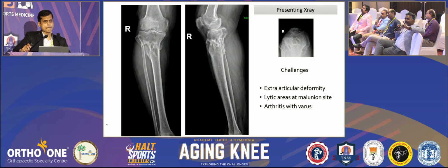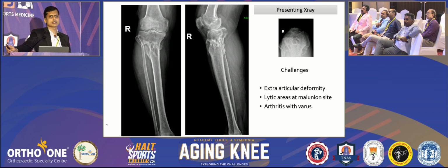The one thing I want to add is that with these sort of malunions or old fracture unions, there can be sclerosis where you can't get your keel inside. So I would probably get a CT scan just to make sure, and I will keep a burr handy. Yes, these are good tips and tricks which you can have in the theatre as an additional thing. If any entry point becomes difficult, you will need extra drill bits and burrs that will help you to make the entry.